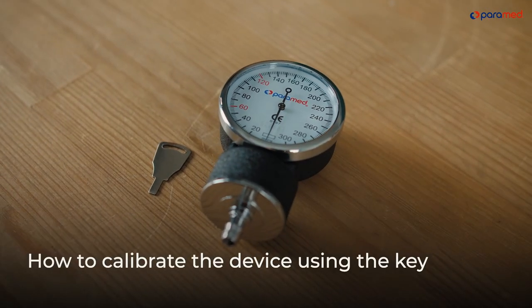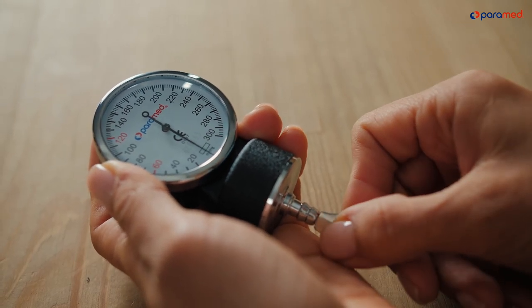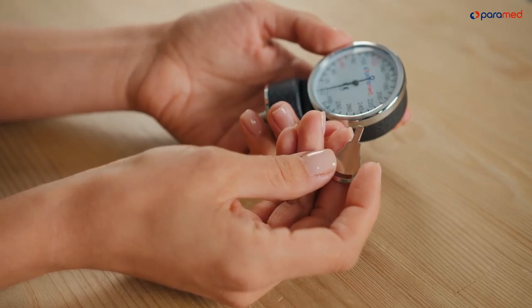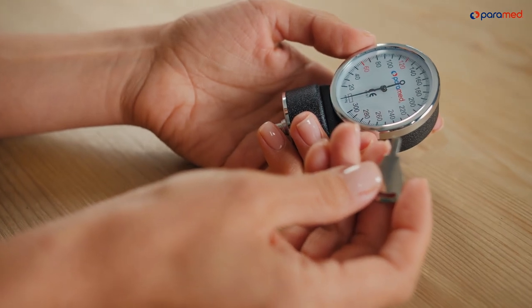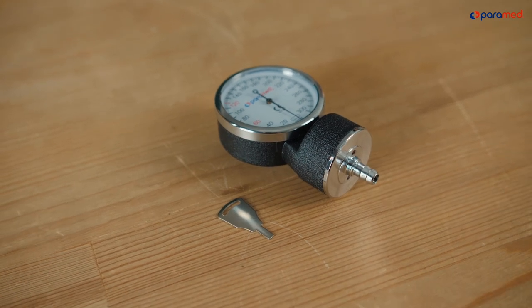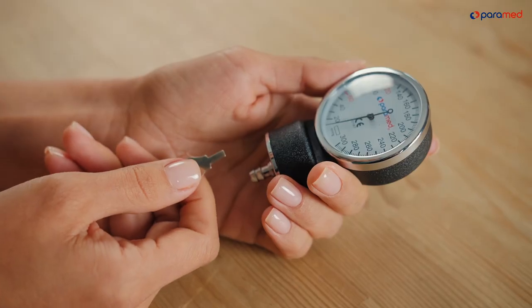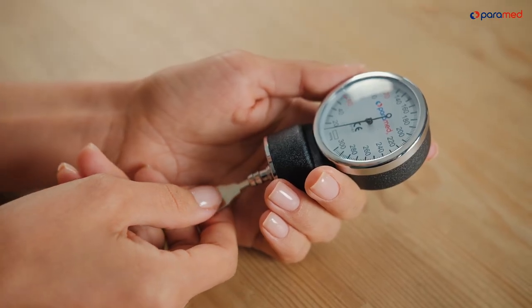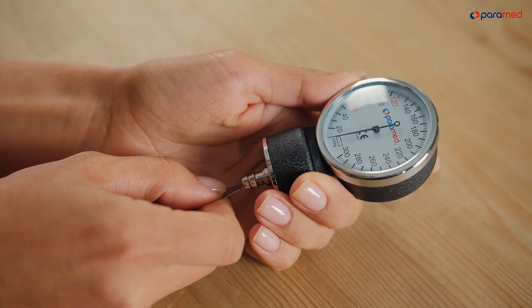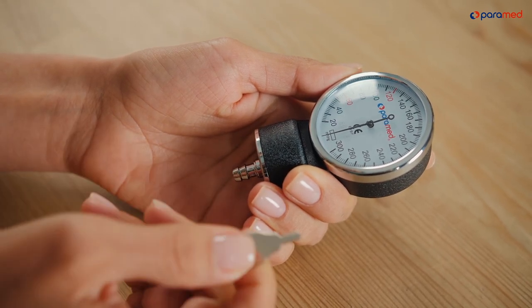How to calibrate the device using the key. If the manometer's arrow is not in the small rectangle, it needs to be adjusted. Insert the key that came with the device into the air guard opening and gently turn it. If you turn the key clockwise, the arrow will move left; if you turn it counterclockwise, it will move right. Once the arrow is within the rectangle, remove and store the key. This regulation will not cause an error in your results. Please note: you can never turn the key a full cycle, as such action will damage the mechanism.